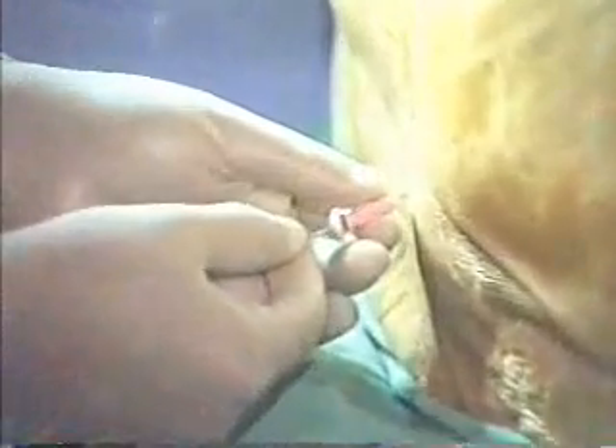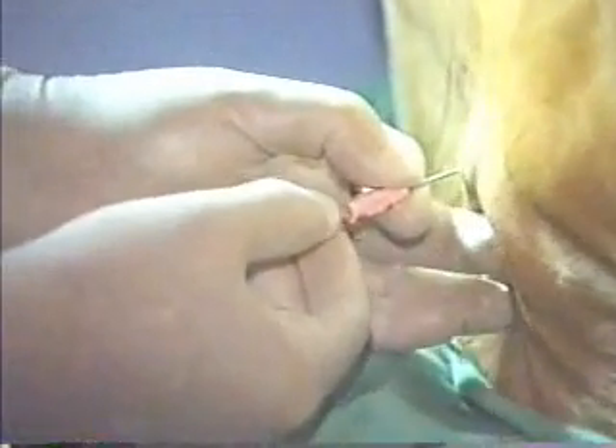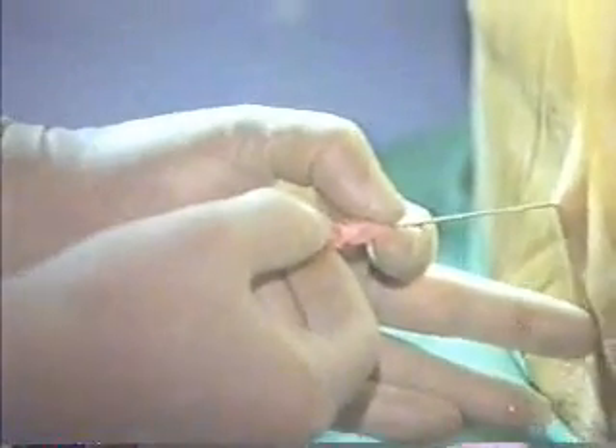That's the point of the needle. So I'm going to put about 5 cm in — that's more than enough. Now I take the needle out carefully. Always keep the needle to the catheter, and then feed the catheter in.